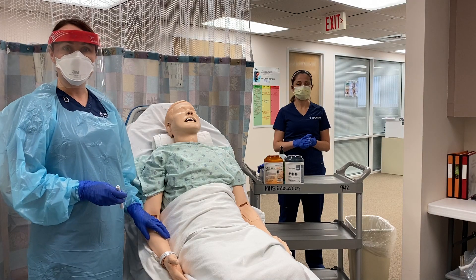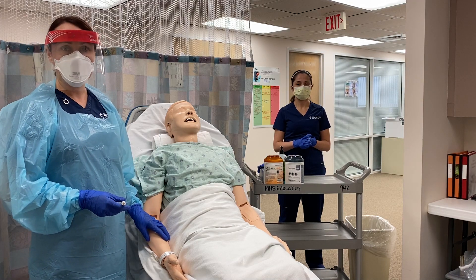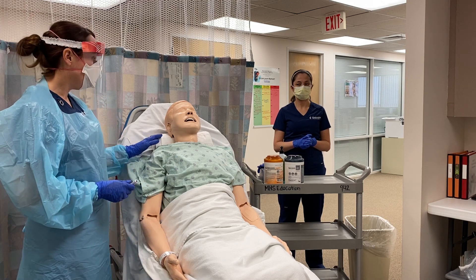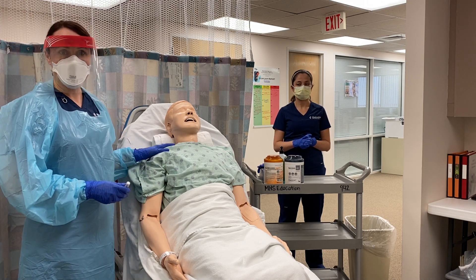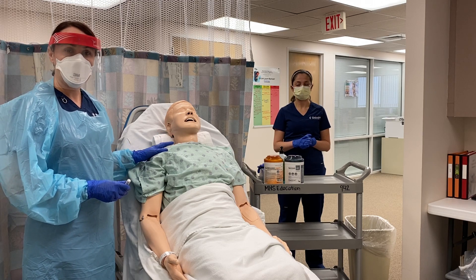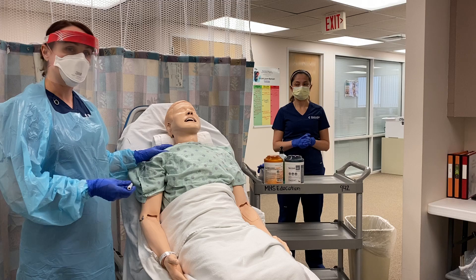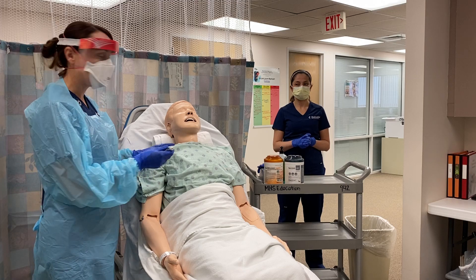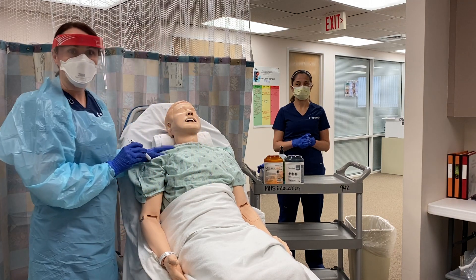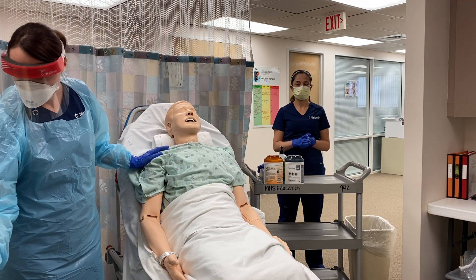Before we collect our nasopharyngeal sample we want to inspect our patient's nares and look for any obstructions. Have your patient hold their head at about a 70-degree angle. If your patient is sitting up like ours is, you can place a roll behind their head to help them achieve that angle. I'm looking to make sure there aren't any obstructions — it looks nice and clear.